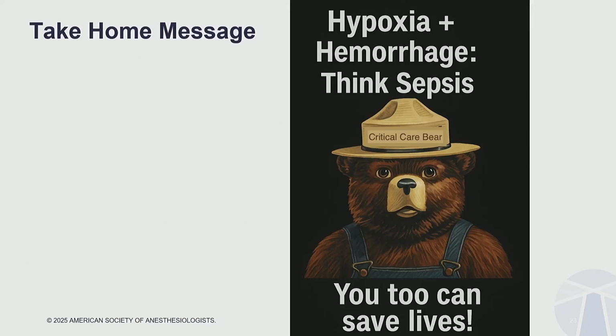Well, I have to be honest, I think in this population, the image acquisition of the IVC is a little overweighted. On one hand, what we've been able to show is that you still have decent feasibility of doing the image acquisition of the IVC in this patient population, but you have to sit them up. On the other, we should not forget it's a marker of right atrial pressure. Especially in a spontaneously breathing patient, the predictive value to predict fluid responsiveness, which is what it is very often used for, is actually very, very low. So I'm not using it for that.